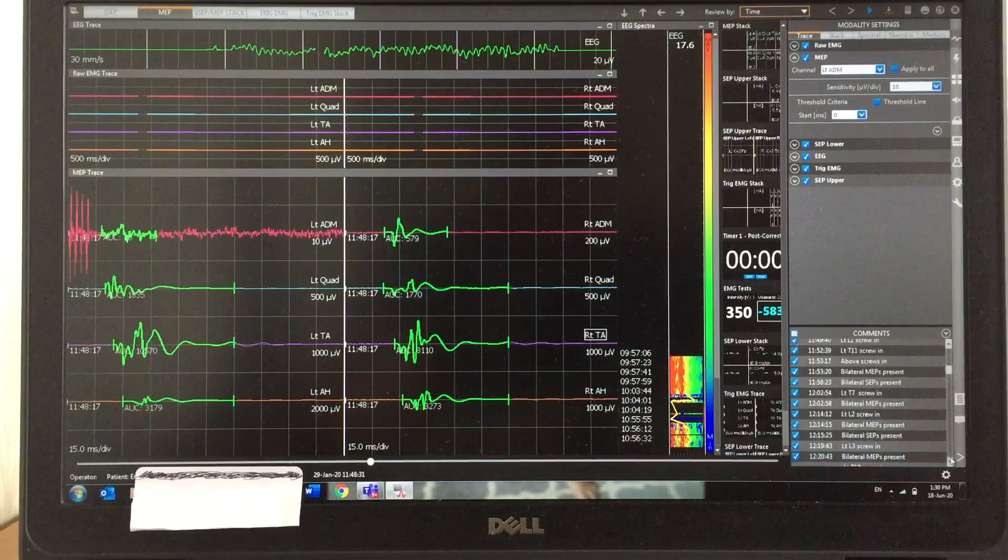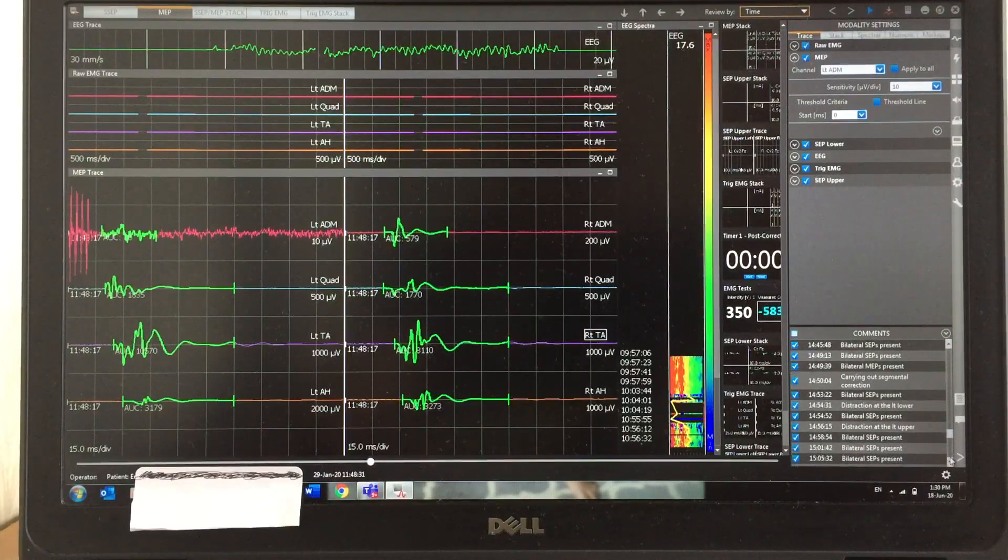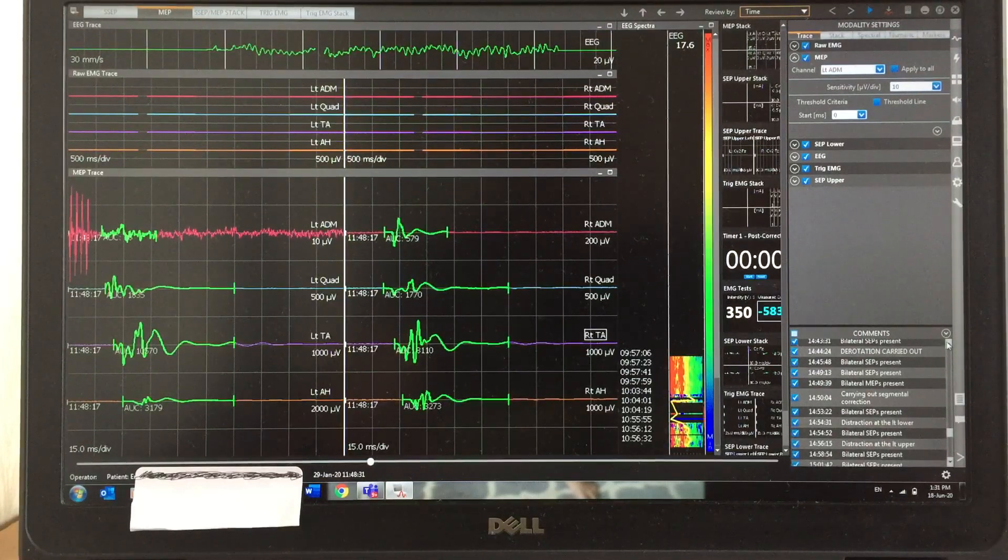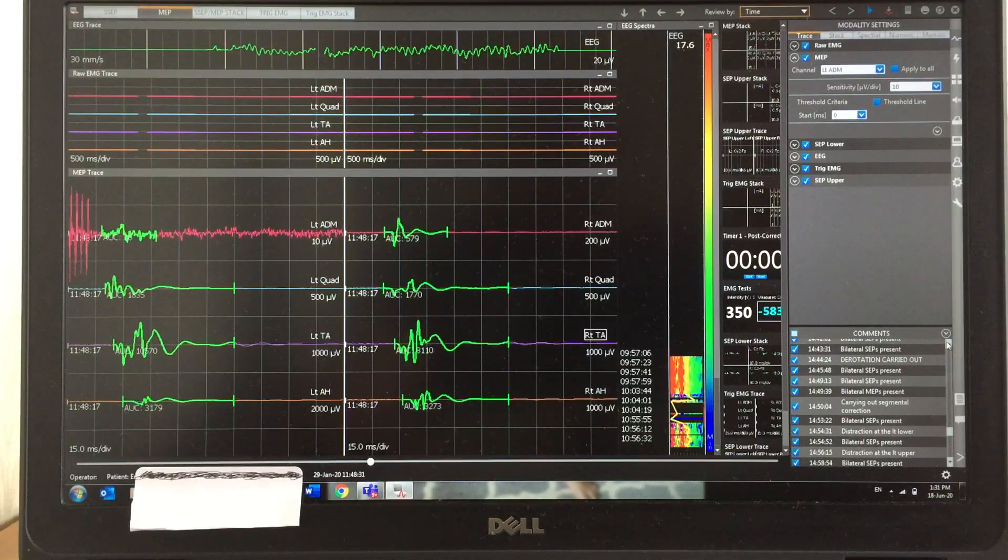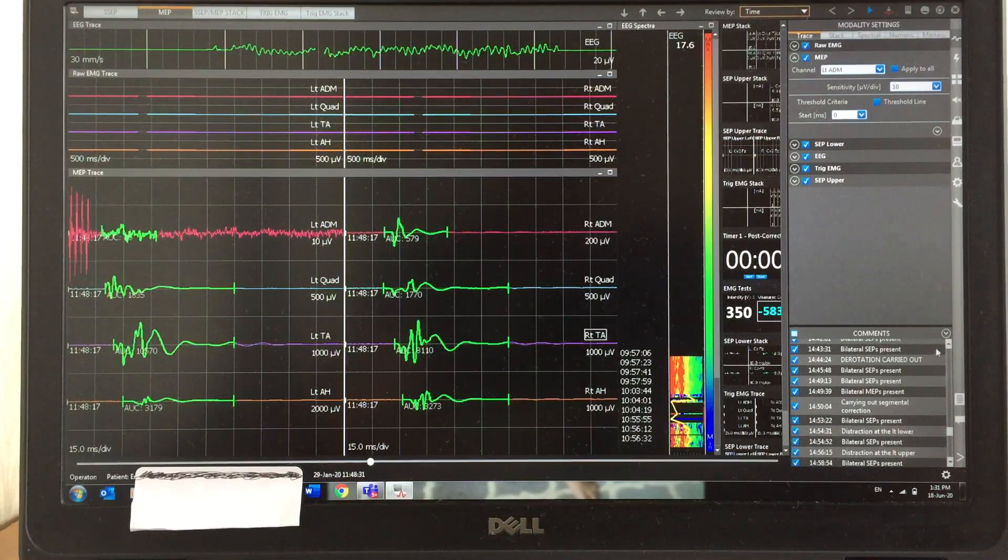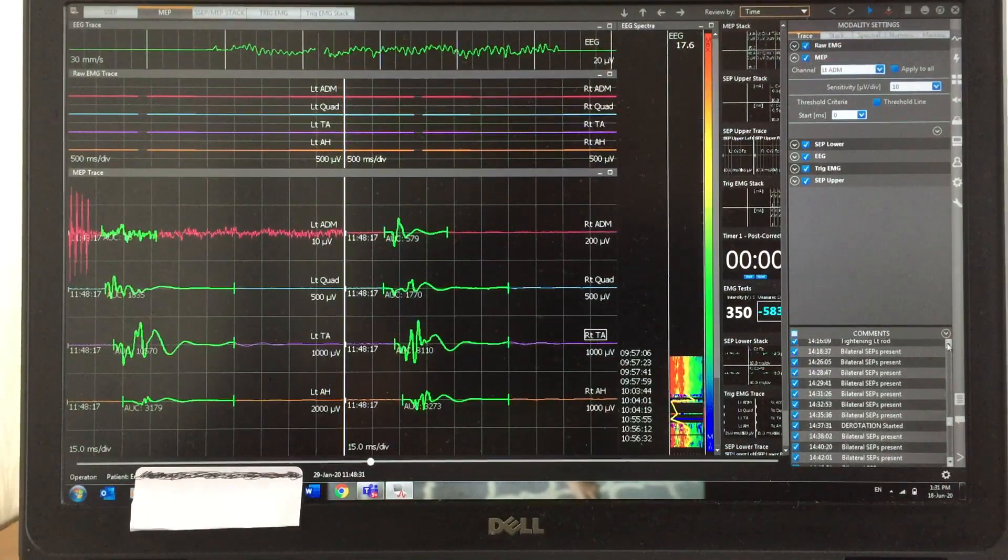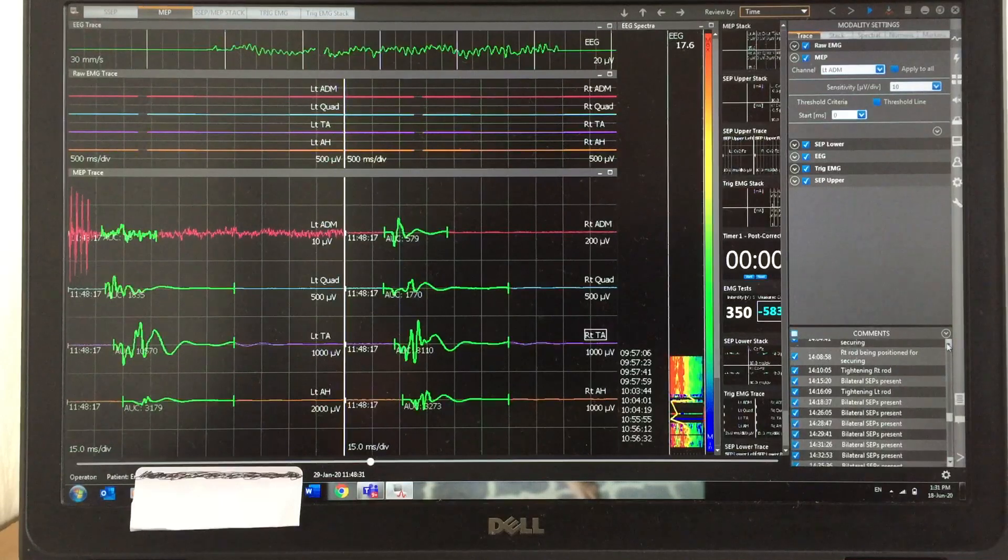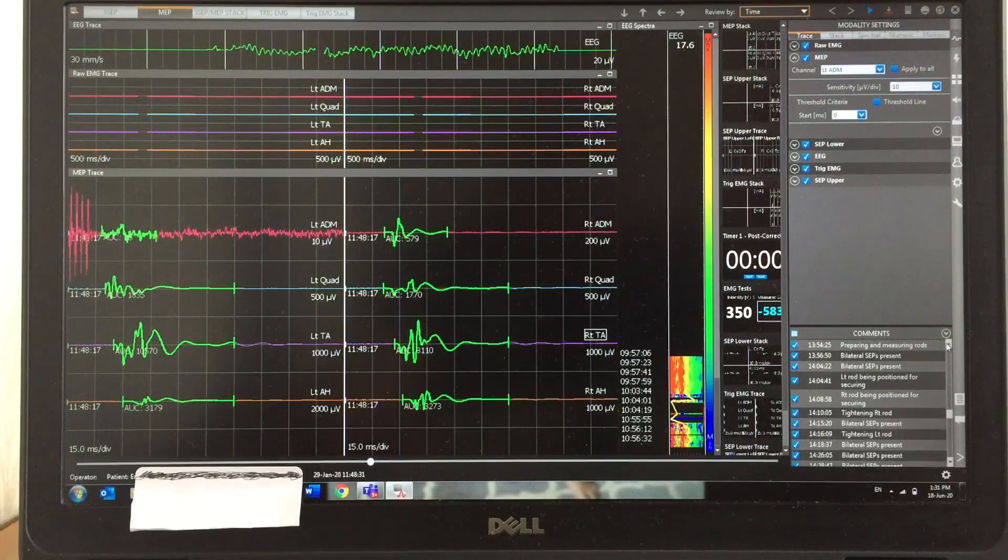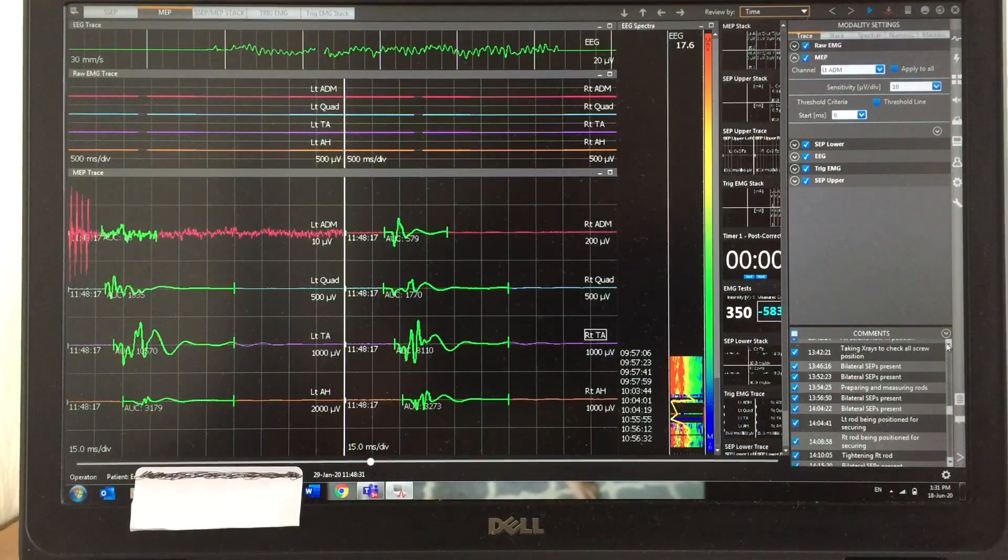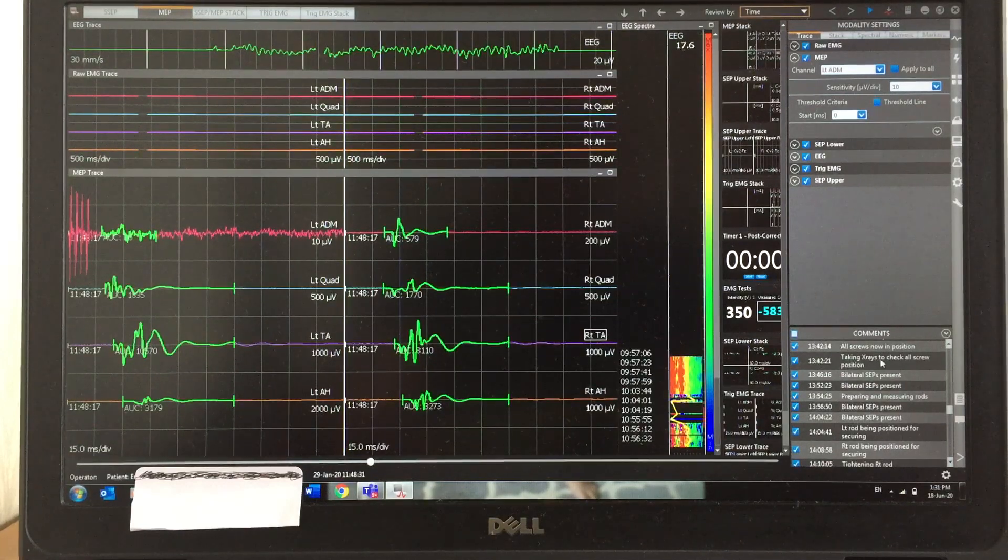The next one is after each screw. If I didn't get response, I would alert the surgeon, but in this case the responses are very good throughout inserting screws. I'm showing you after all the screws in. I'm recording MEP responses after each screw and finally after all screws in. You can see taking x-ray to check all screw positions.